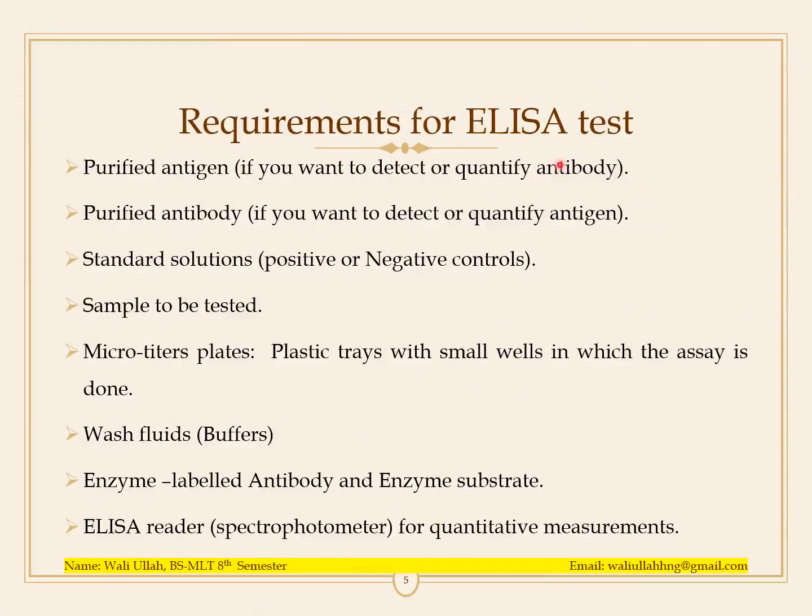Requirement for ELISA test. The following are required while performing ELISA. Purified antigen when we detect or quantify antibody in a sample. Purified antibody when we detect or quantify antigen in a sample. Standard solution. Sample to be tested.